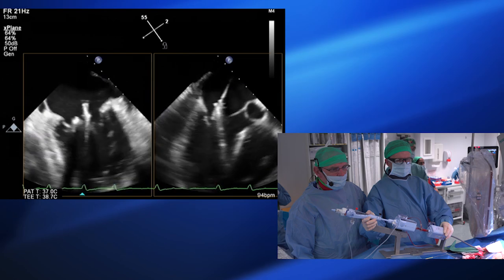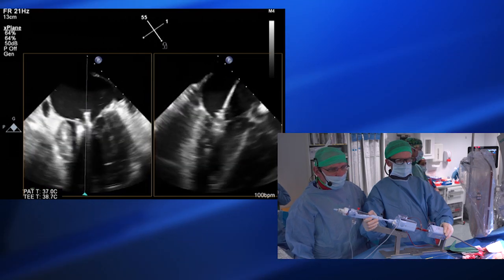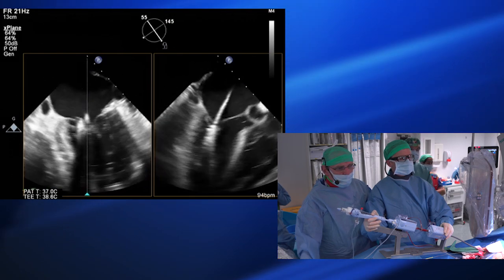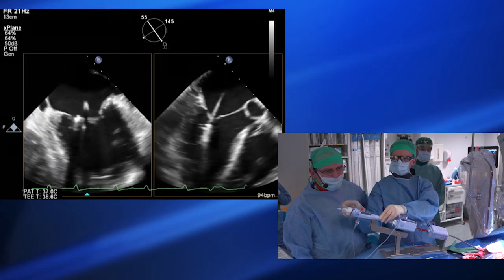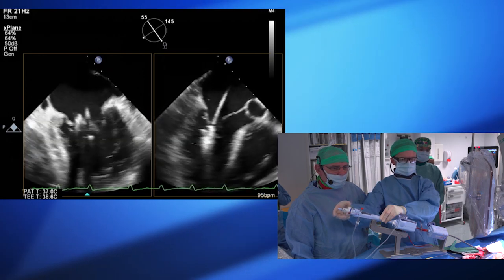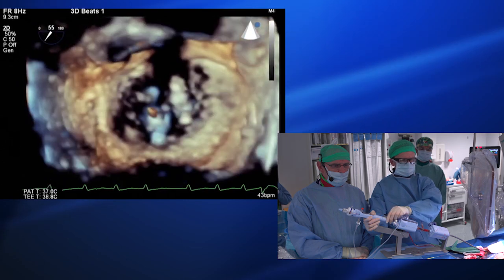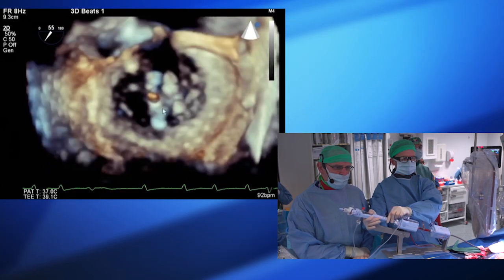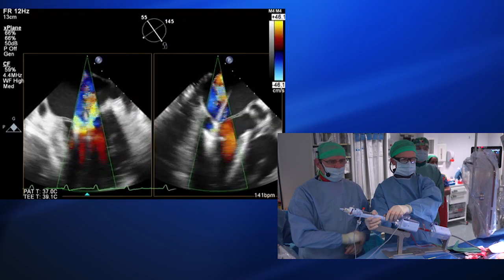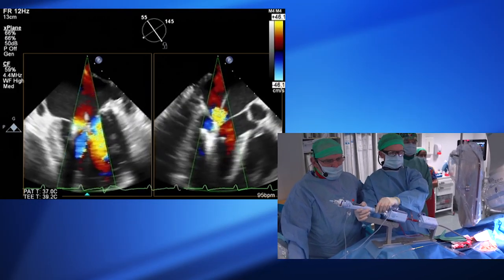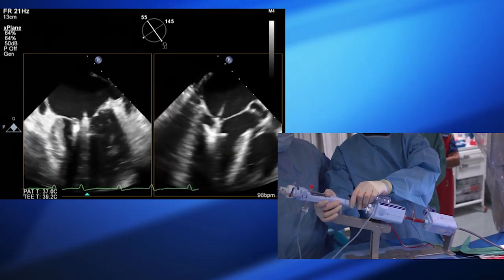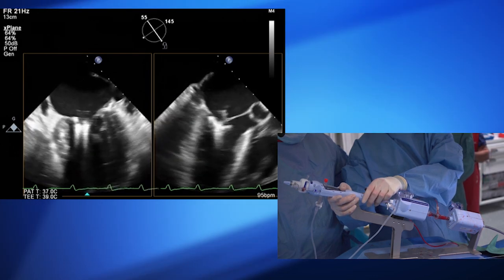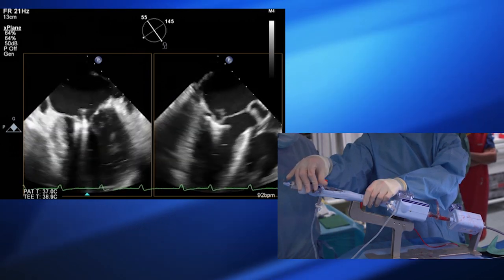I'm very carefully coming across, correcting the AP direction as needed. As you see on fluoroscopy, they're absolutely parallel and not interacting. Making sure I'm properly under the valve. Now we can open again. Might clock a fraction. The previous clip is on the right-hand side there — this is the first clip, this is the new clip. The gain is deliberately down, otherwise you can't see much through the valve leaflets. The colour seems to be about right, splitting the colour pretty much. As I come up I'll use fluoroscopy as well just to make sure we're not interacting with the other clip. Definitely on there. I'm going to try and get a bit more posterior. It's important to resist the temptation to pull up too much because if you do, you'll get more of a gradient.